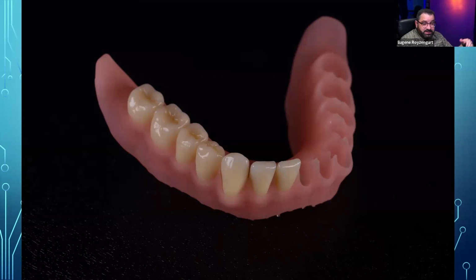Another way to get things done, you can actually use carded teeth, guys, with either printed or milled base plates, and they look really nice. I haven't done too many of these. I mostly just print stuff nowadays because, unless I'm milling a base, I still don't want to use that for my final restoration. And using carded teeth for temporary is just kind of a lot of cost. So I won't do it this way, but it's just my own personal preference.